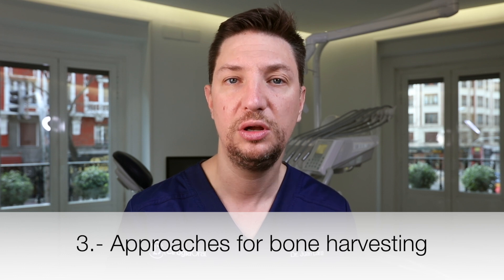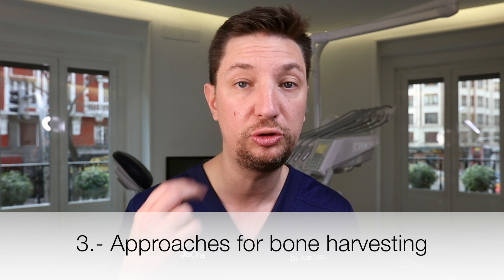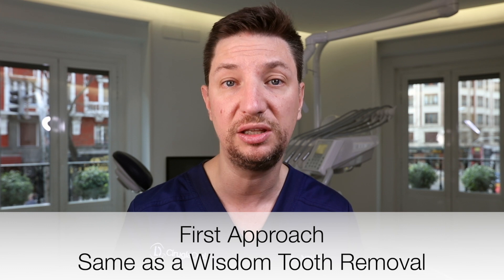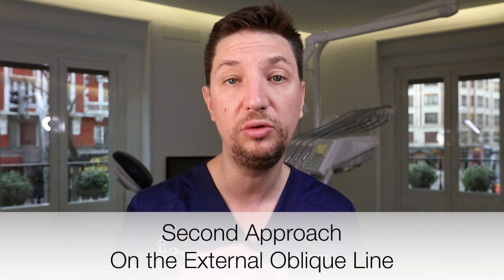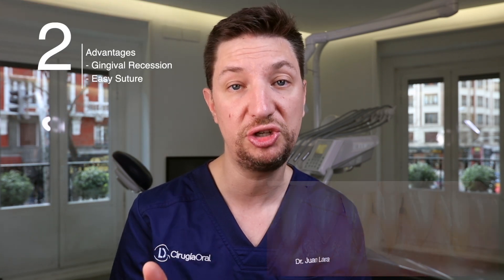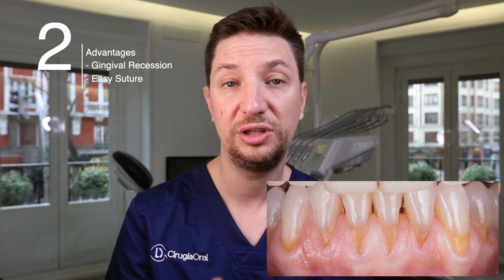The third tip is the approach to harvest a bone block. We can perform mainly two approaches. The first one is the same used when removing an impacted wisdom tooth: an intrasulcular incision, one vertical release incision mesial to the first molar, and one vertical posterior incision up to the ramus. The second approach is right on the oblique line of the mandible. The advantage of the second approach is that we are not going to have any recession on those teeth, and the suture is going to be really easy.